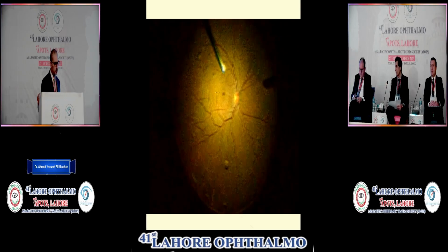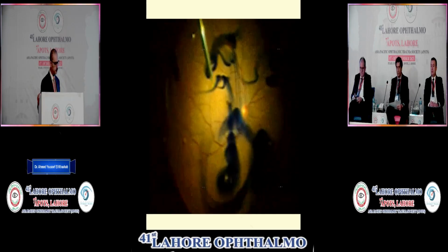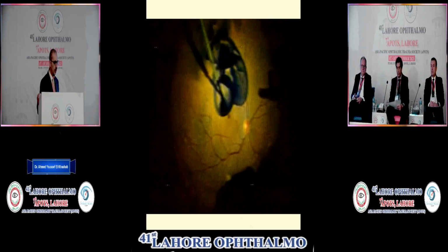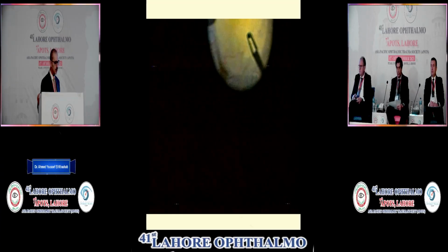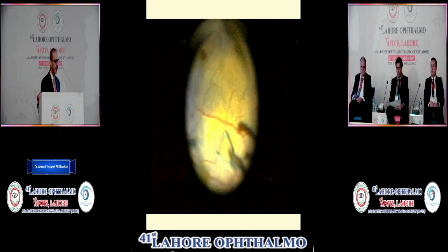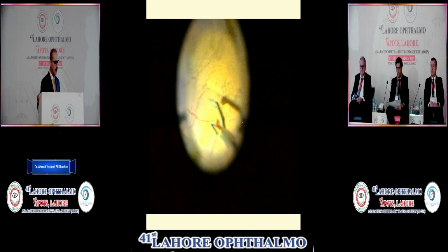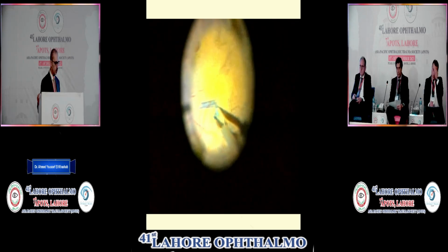We can work the video. I usually prefer to use dual membrane blue as a stain, to make sure that it has a better staining of both the ILM and, if there is an epiretinal membrane on top, this would give a better stain of the hole.